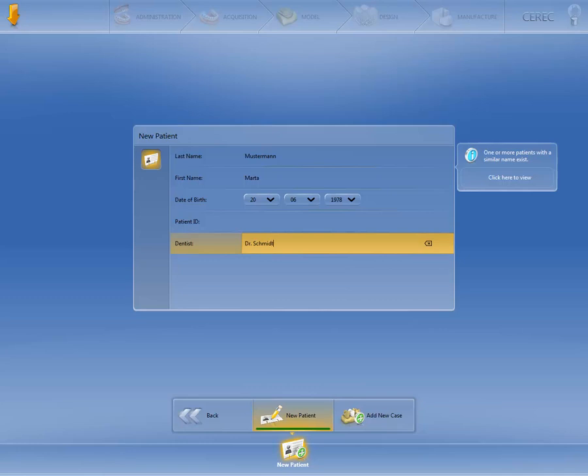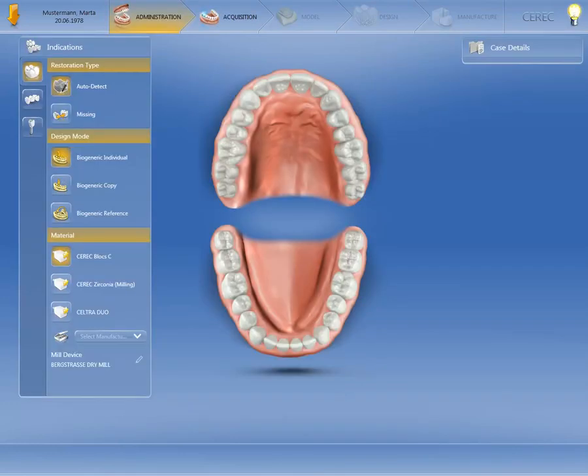Once you have completed the required fields, click on Add New Case. This automatically takes you to the administration phase.